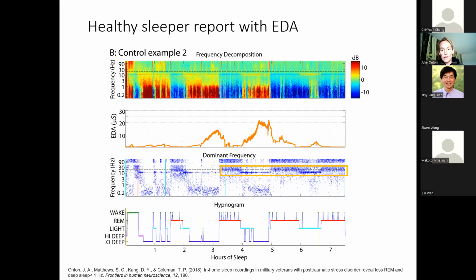Here's an example of one of these very clear things when you're looking at the data like this: the difference between REM and non-REM sleep. Non-REM sleep has spindles, REM sleep does not. So the easiest way to find what's REM sleep and what's not is to see if there are spindles or not. If there are no spindles and there doesn't seem to be any strong gamma activity, then it's most likely REM sleep. And you can see it very clearly when you look at the data in this way.